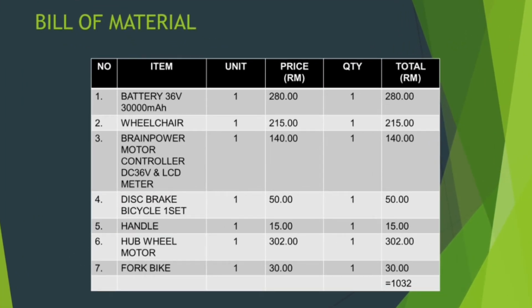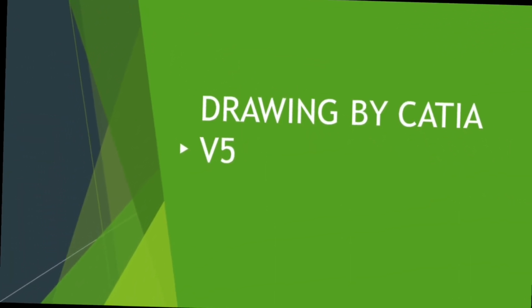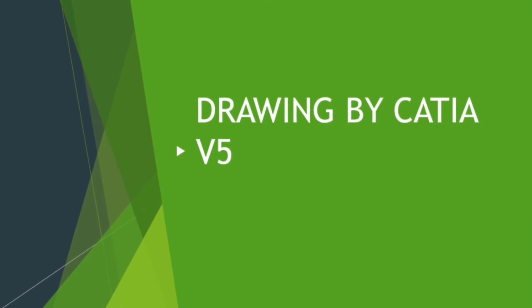Bill of material. Total cost of this project is RM 1032. Drawing by Catia V5.